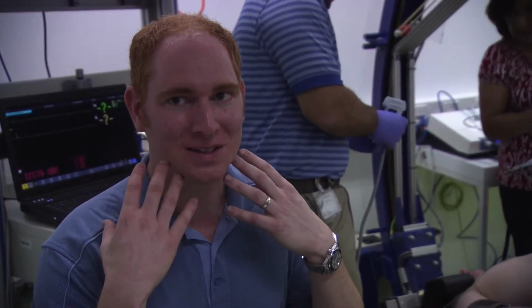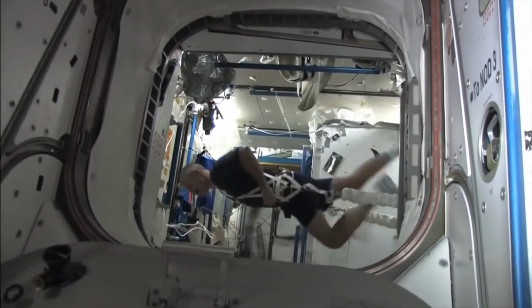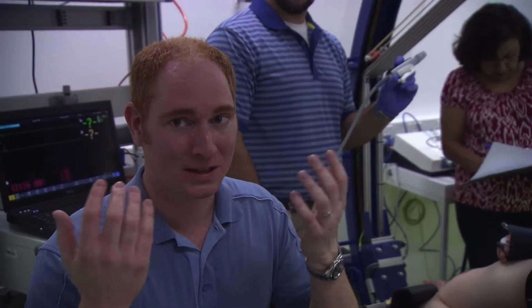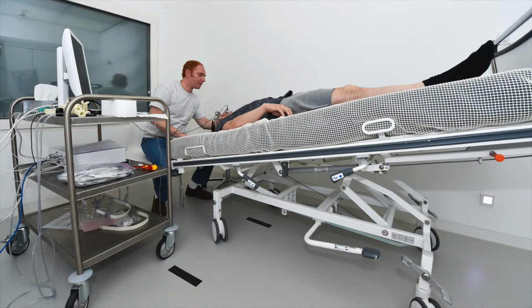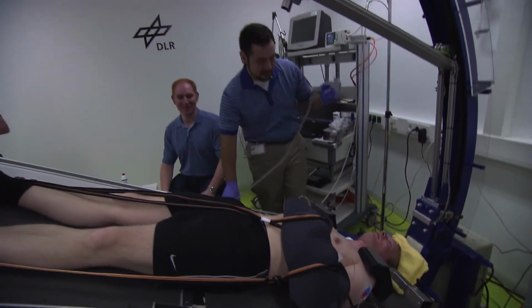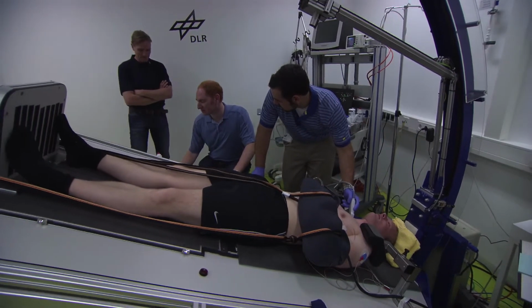What we're trying to see is the effect of head-down tilt on the size of the internal jugular veins, because in outer space, fluids shift up toward the head, and one of the ways we can tell how much blood is in the head is by looking at the internal jugular veins, since those are the main way that blood can leave the head. So we're trying to simulate that with the tilting, because tilting also causes the blood to accumulate in the head, and by looking at the internal jugular veins, we can get some idea of how one person may be susceptible to the effects of fluid shifting to the head.